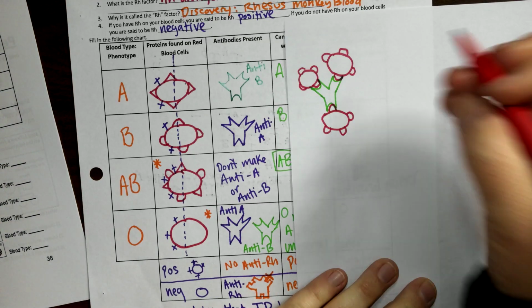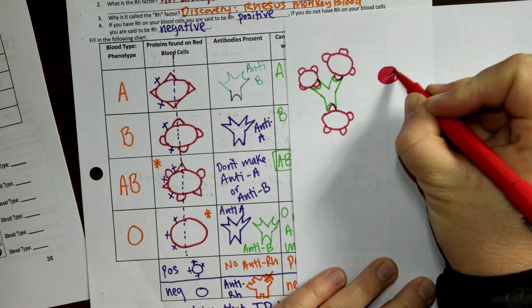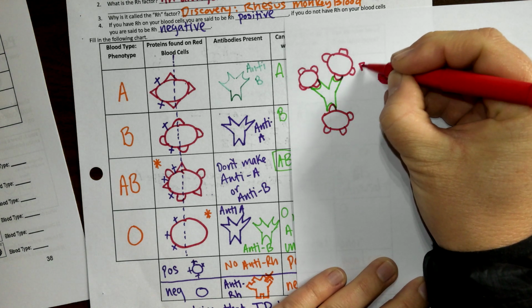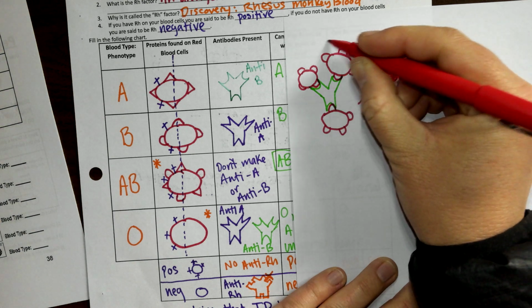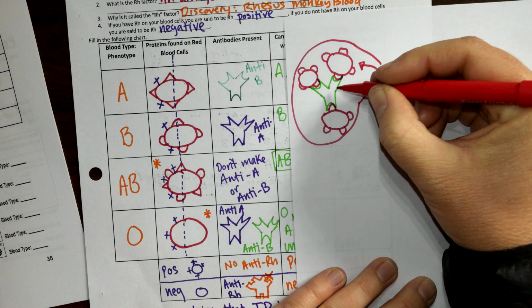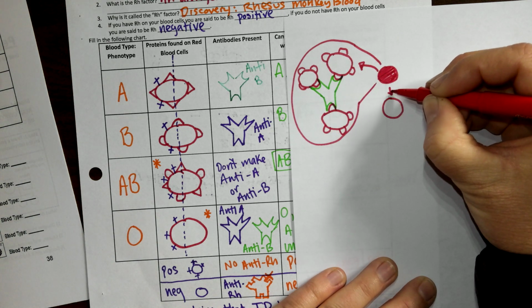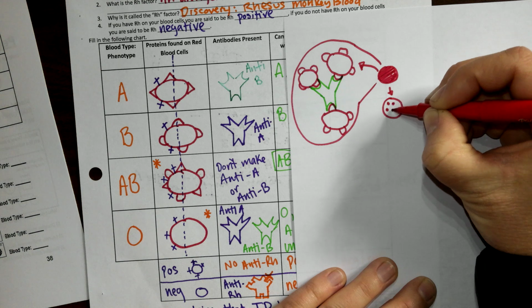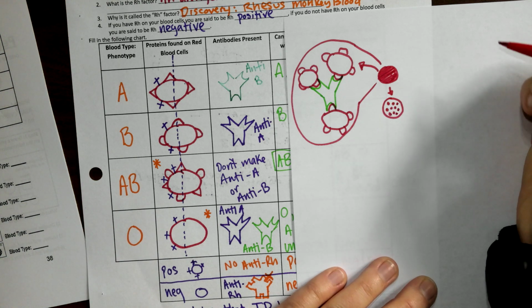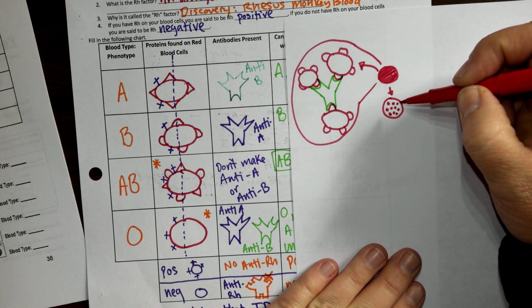So if you had a droplet of blood that was nice and smooth, and then you added some anti-B to it, on a microscopic level, when we blow this up really big, what's actually going to happen if we add anti-B to somebody who has B blood, then the blood over time will start to form little clumps like this, and we'll start to see little dots. This is what would happen in your body if we did it in your body.